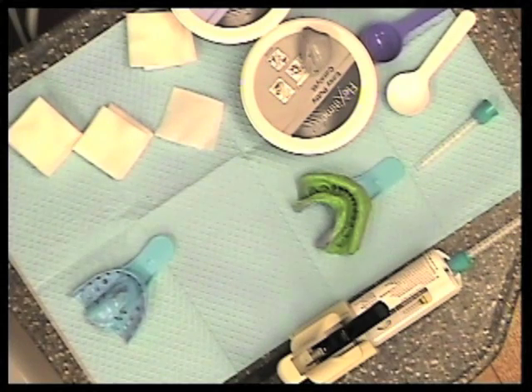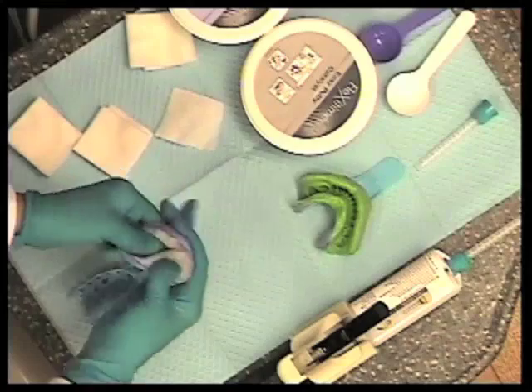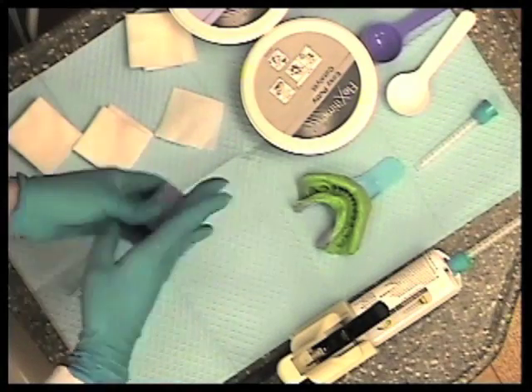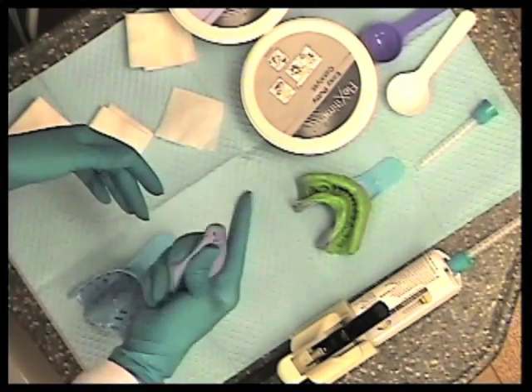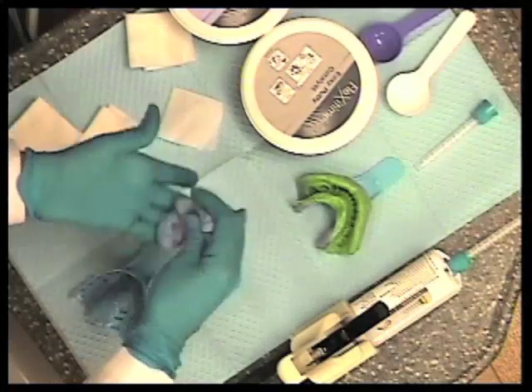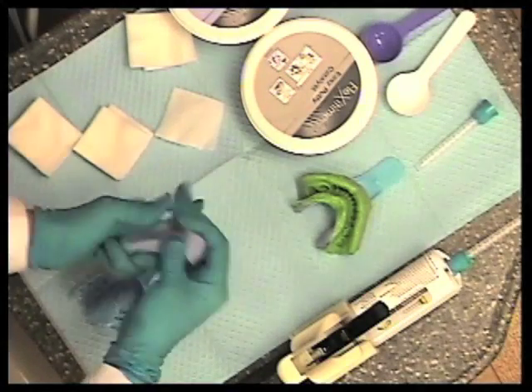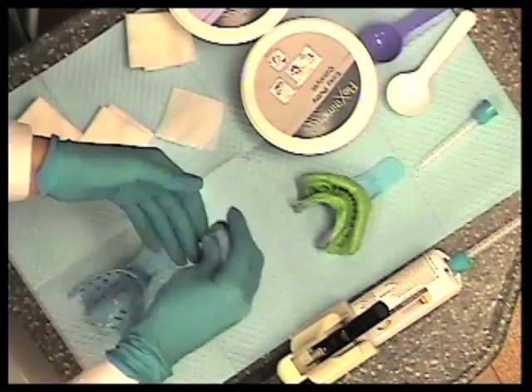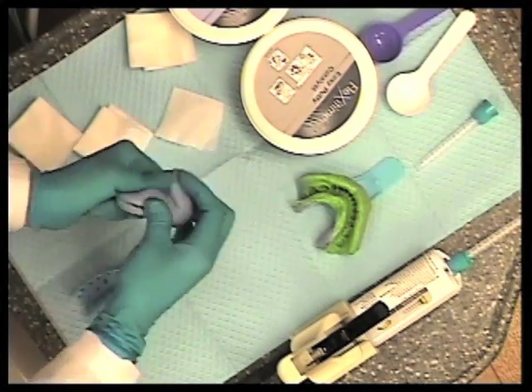All right, now for the maxillary impression, we're dealing with basically the same thing. We're going to get our putty first, and again, go through the same process of mixing it in your fingers. The one thing that I would suggest is that you want to make sure you get the palate here, so you might be using just a little bit more material. You want to make sure you get the teeth as well as the entire palate, all the way back to the hamular notches, and then all the way up the land area to the mucobuccal fold there. So you need to have enough material. But notice how she's mixing it in her fingers to that uniform color.